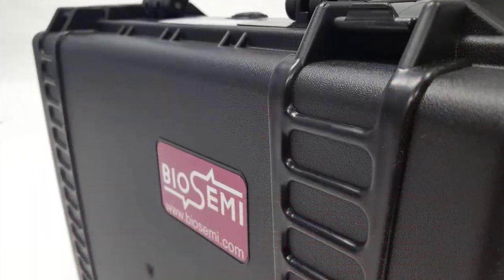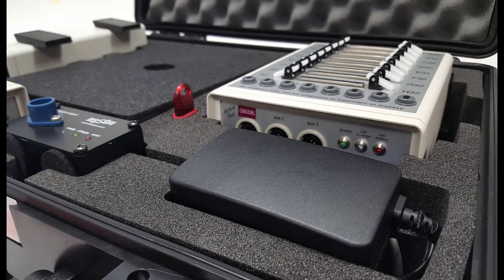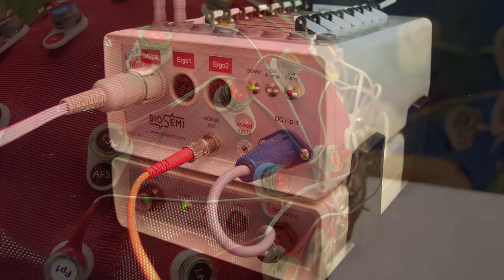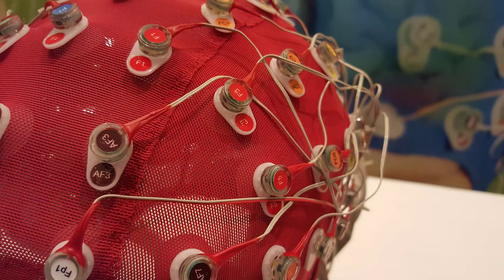Preparing consumable supplies, measuring for head cap size and position, applying the cap and electrodes, checking electrode contacts, monitoring signals, saving data, removing the cap and electrodes, washing and disinfecting.